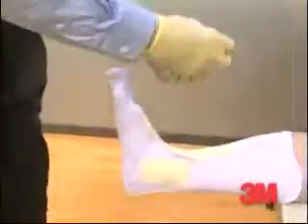So now we'll wet the material. Then as we come back down the ankle, we're coming around and we'll do a heel lock on the lateral side, and then a heel lock on the medial side, and then we'll come around and cover both heel locks, and then one last figure of 8 with the remaining material. So as you can see, it's a very quick and easy application technique for wrapping.